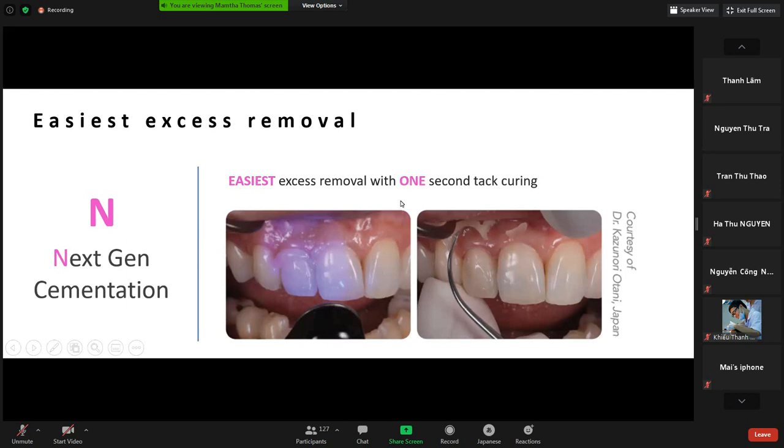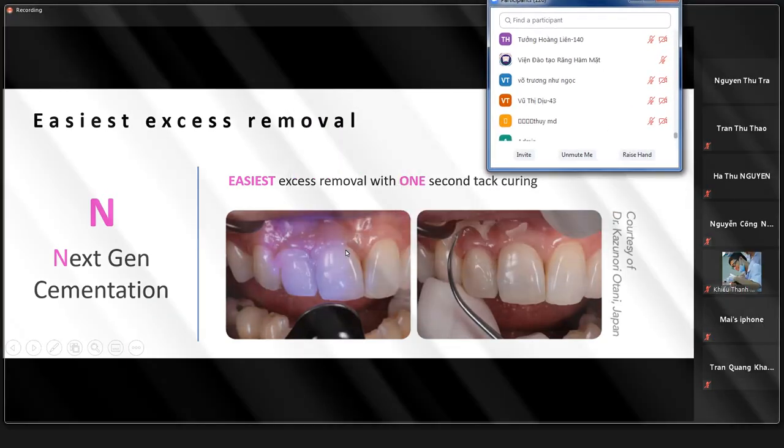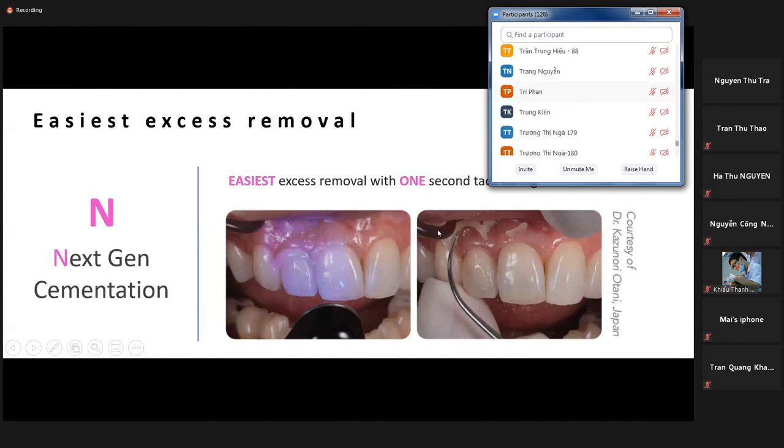A 1-second tack curing is what we would recommend if we want to remove the excess by light curing. So we just kind of wave the light cure unit over the tooth, and a second is enough for us to be able to remove the excess.